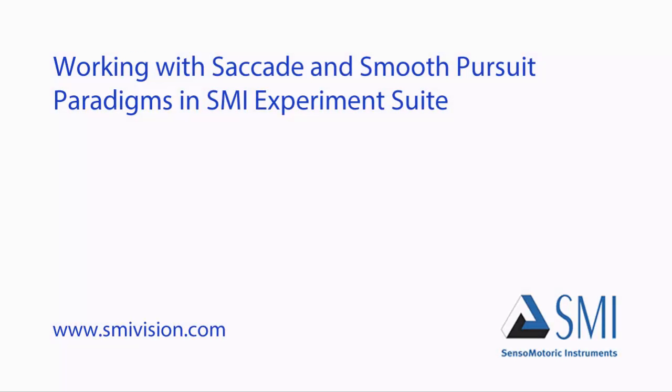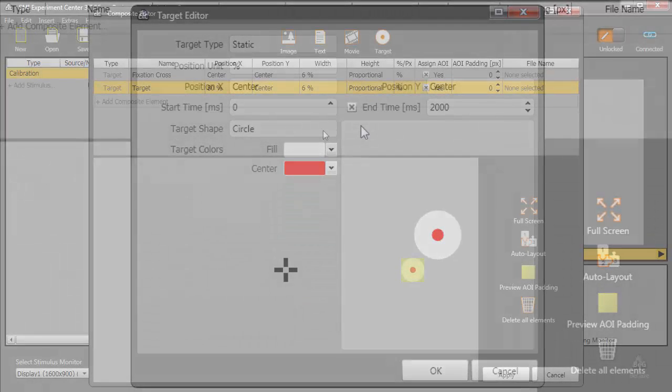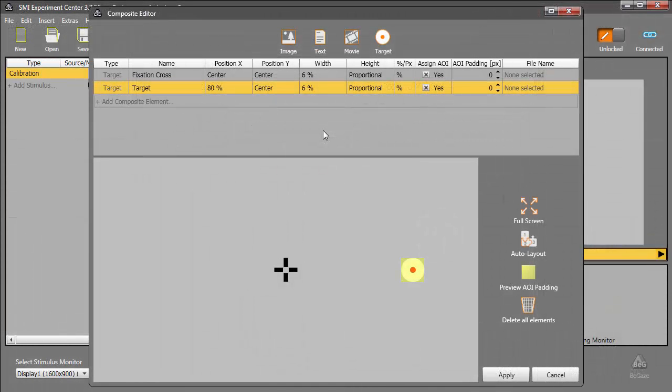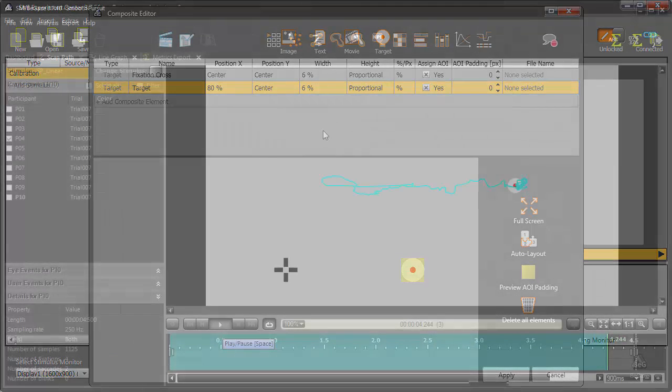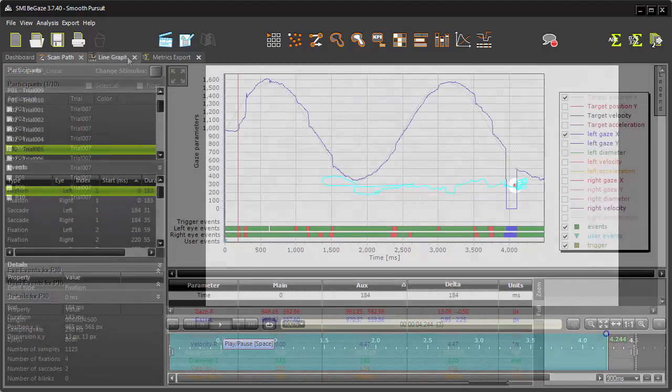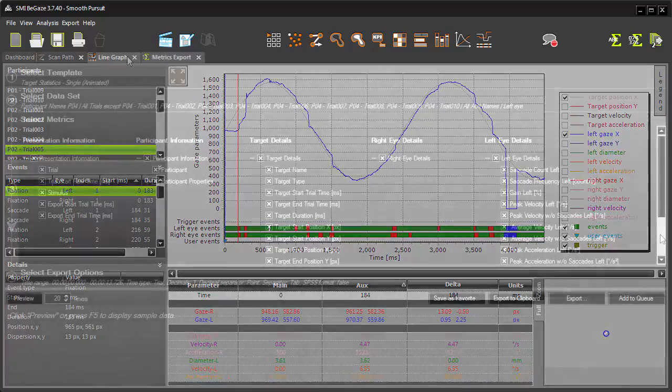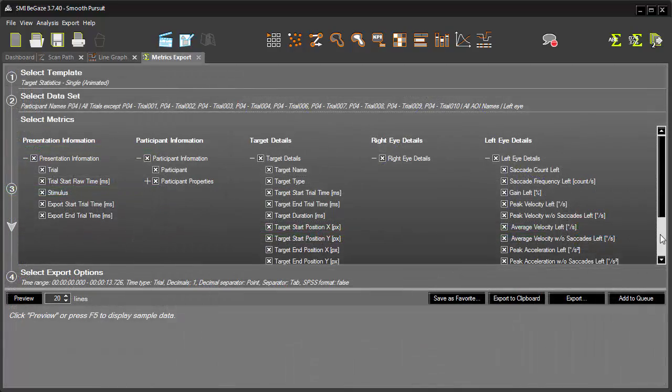Welcome to the tutorial, working with saccade and smooth pursuit paradigms in SMI Experiment Suite. SMI Experiment Suite includes a rich set of tools for the design and analysis of saccade and smooth pursuit paradigms. The study and analysis of such parameters has a fundamental role in neuroscience, psychology, and clinical research fields.